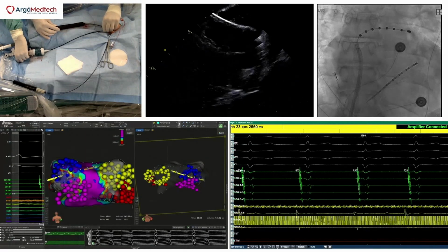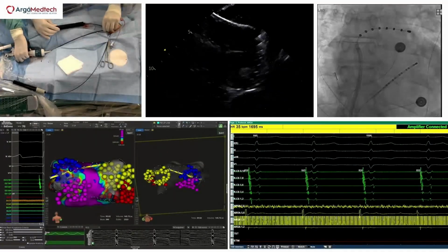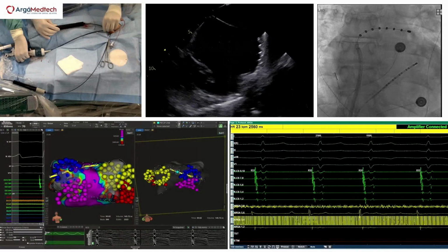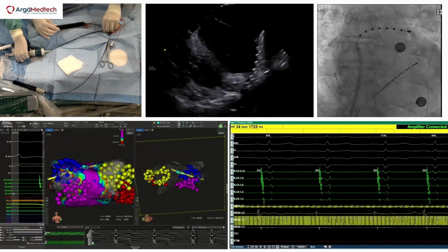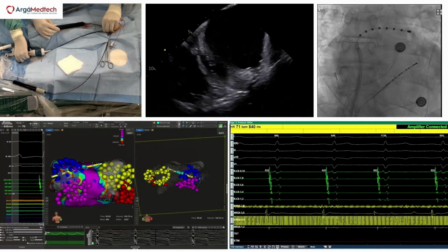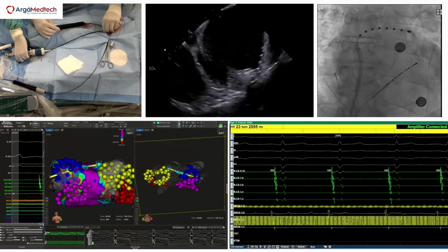Guys, you see this? Yep. Back 4 max. You see good contact on ICE. Back 4, wait. Back 4 max. You see good contact? Yep. Look, fantastic footprint. As soon as you program, we're good to go. We do back 4 max, go.